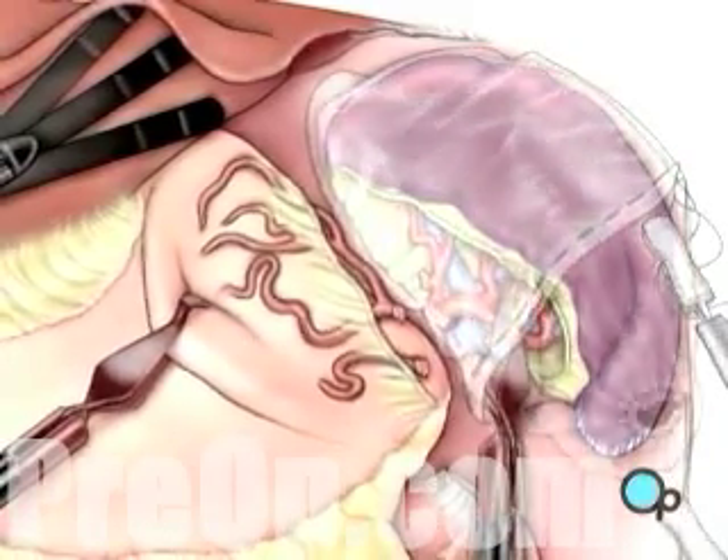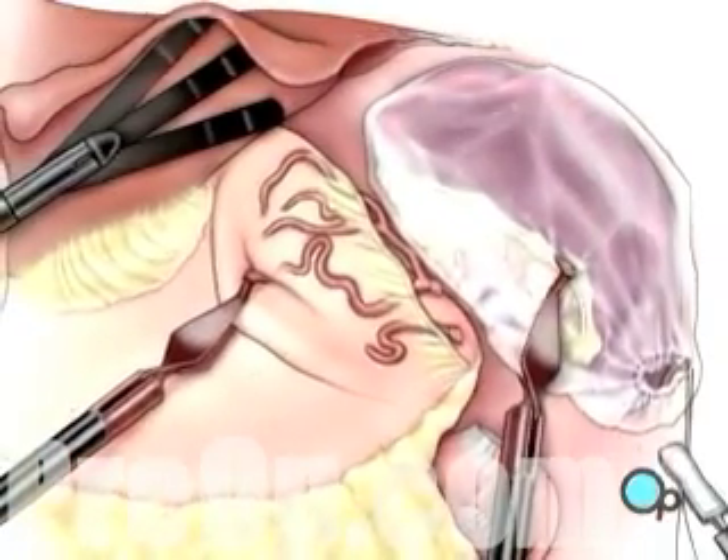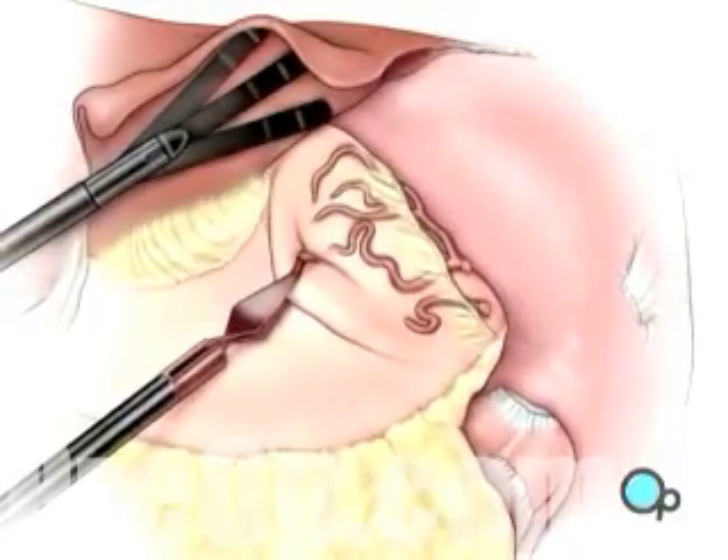Finally, the spleen is maneuvered into a special retrieval bag, where it is broken into smaller pieces and removed through one of the laparoscopic working ports.